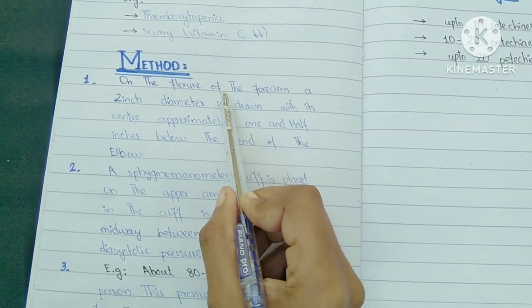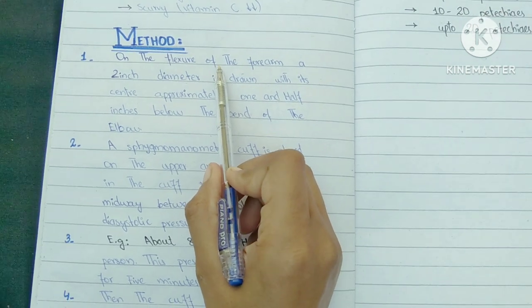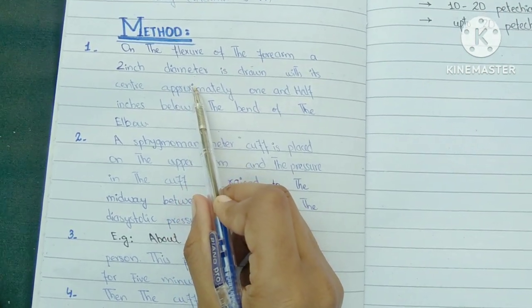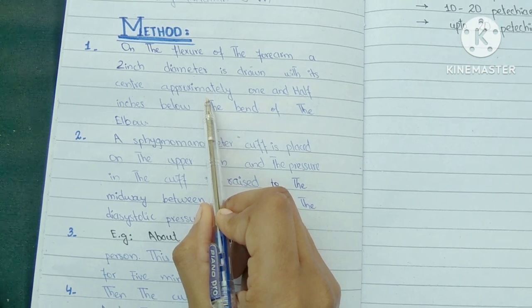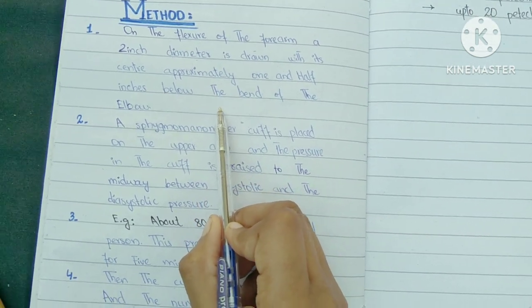If we talk about the procedure and method, first, a circle of two inch diameter is drawn on the flexor surface of the forearm with its center approximately one and half inch below the bend of the elbow.